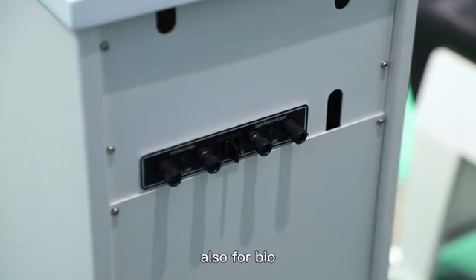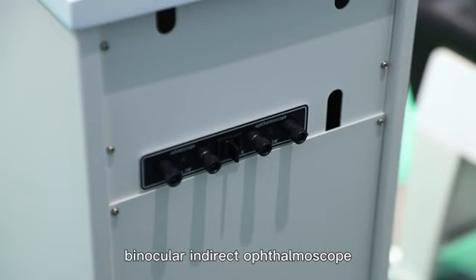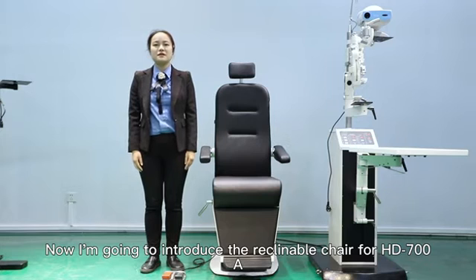Also for BIO — binocular indirect ophthalmoscope. Now I am going to introduce the reclining chair for the HD700A.